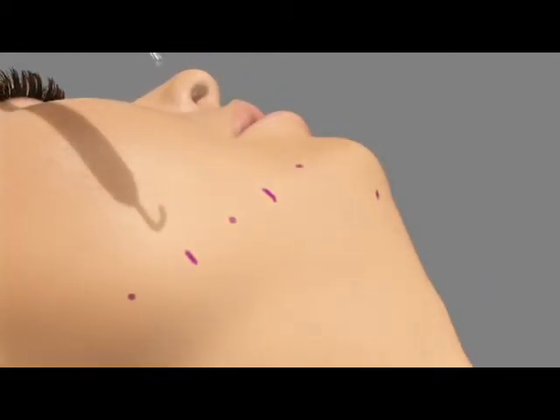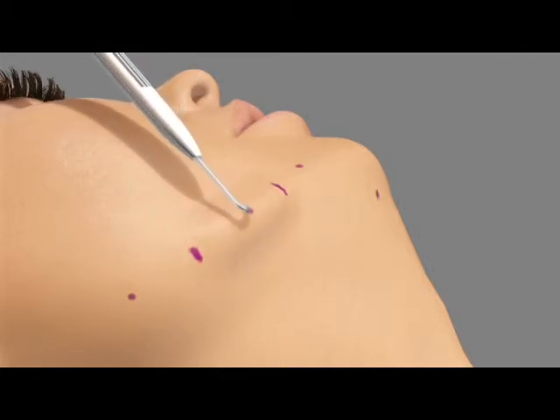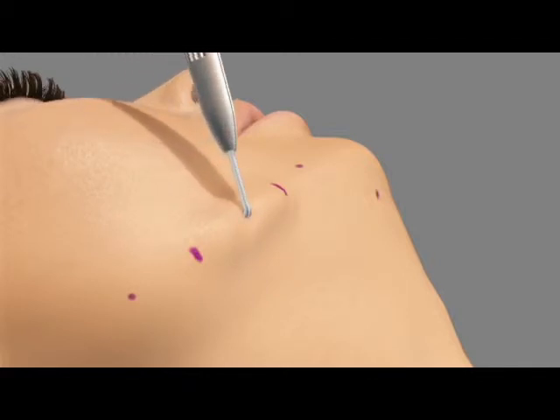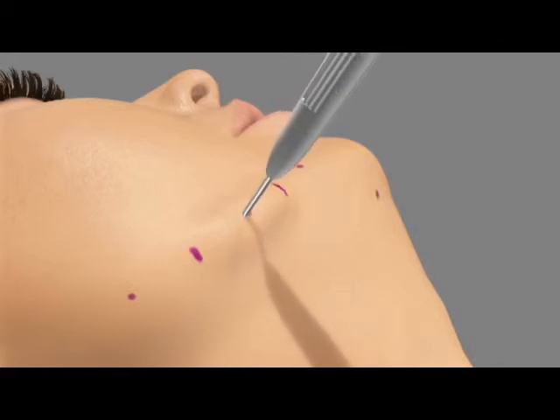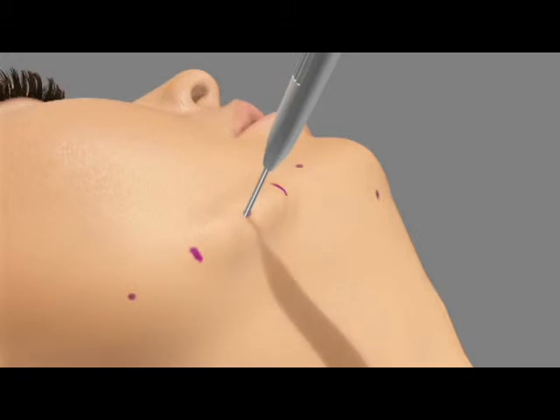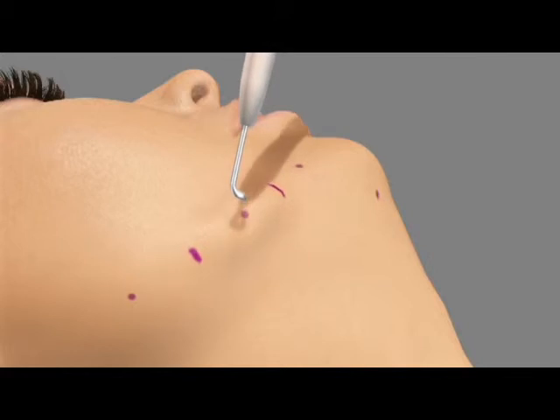The dermal attachments are then cleared using the clearing device, which is inserted in each puncture and carefully rotated clockwise 2 to 3 turns, allowing the sweeping away of the dermal attachments. The sequence of each maneuver is just the same in the neck-defining suture in order to create the surgical field and prepare it for the light-guided suture rod.